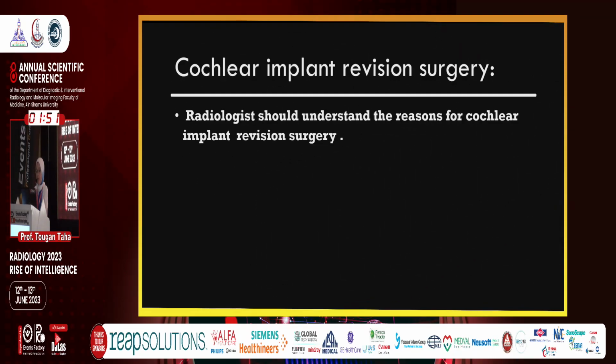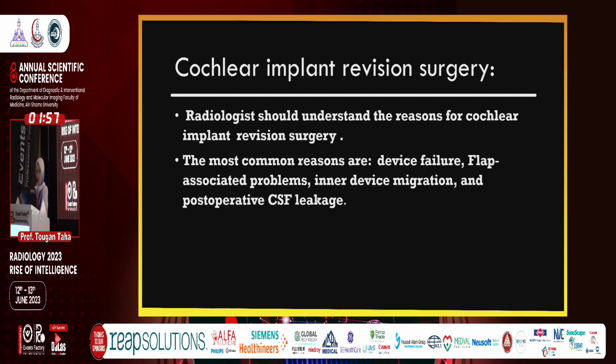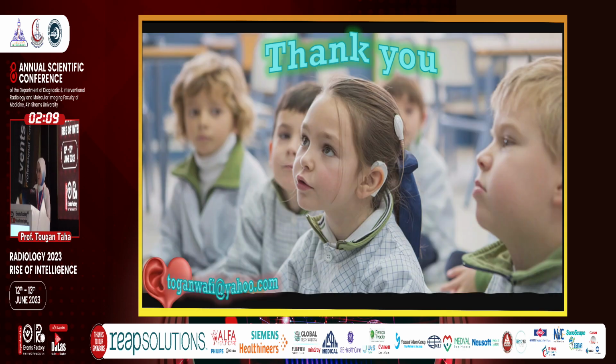The radiologist should understand the reasons for the cochlear implant revision surgery. The most common reasons are device failure, flap-associated problems, inner device migration, and post-operative CSF leakage. Thank you.